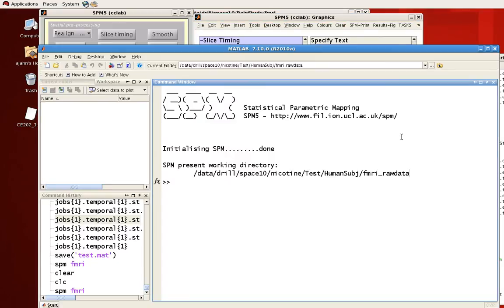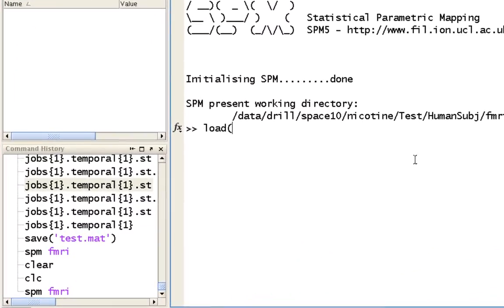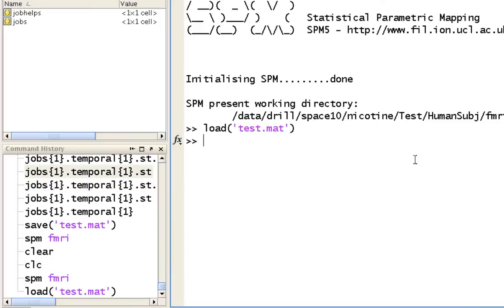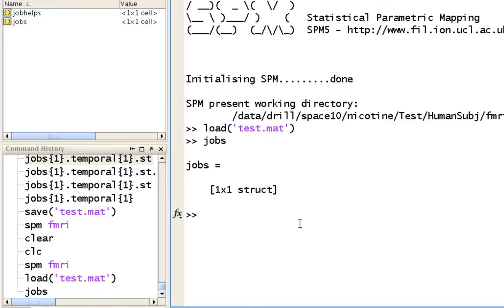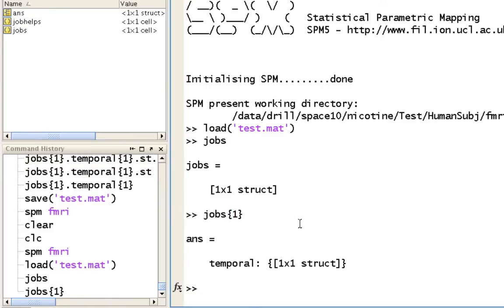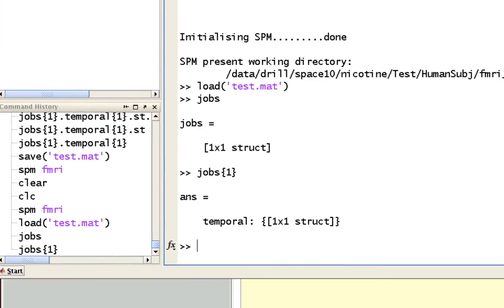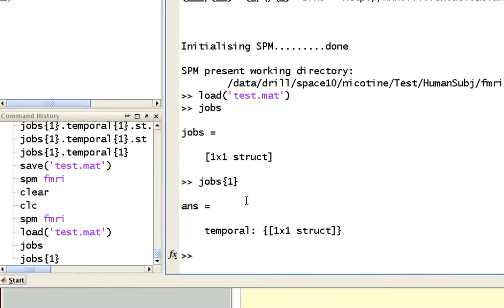So going back to our command line, if we load this test.mat file, notice that we have these two new variables here. There's jobs and job helps. Let's focus on jobs for right now. So we can see here that it's a structure, and we look within the first cell of that structure, we get this field called temporal. So let's look within there again.